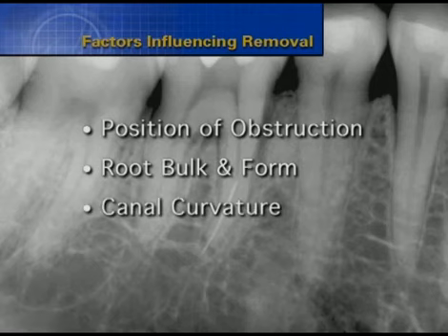In addition, instruments that lie in the straightaway portions of the canal can typically be removed. Separated instruments that lie partially around canal curvatures, although more difficult, can oftentimes be removed if straight-line access can be established to their most coronal extents.